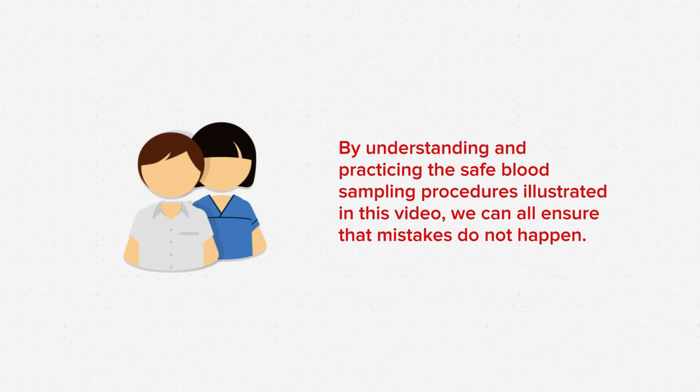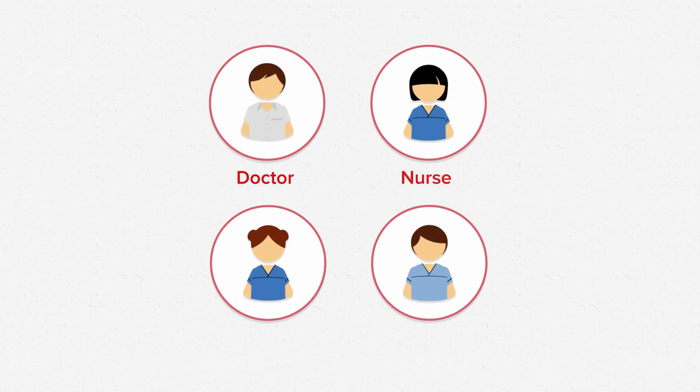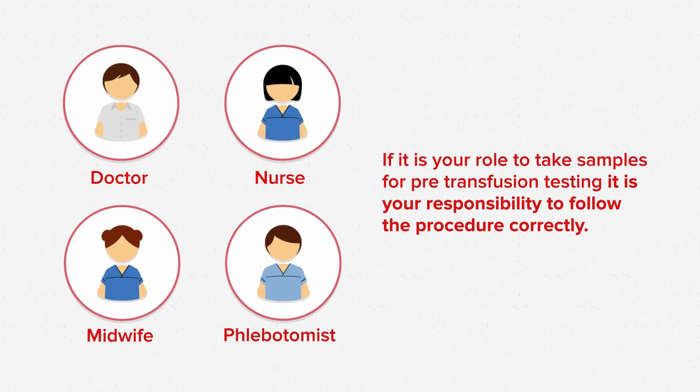By understanding and practicing the safe blood sampling procedures illustrated in this video, we can all ensure that mistakes do not happen. If you are a doctor, nurse, midwife or phlebotomist, and part of your role is to take samples for pre-transfusion testing, it is your responsibility to follow the sampling procedure correctly.